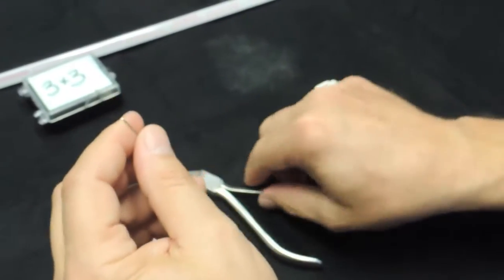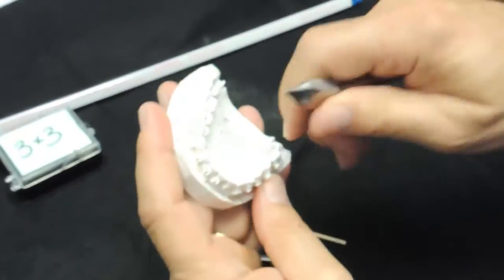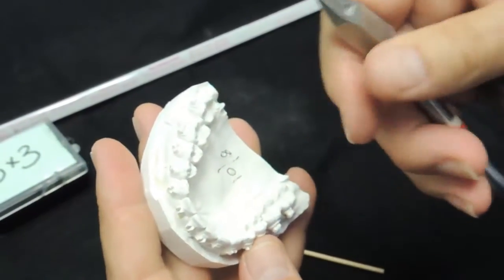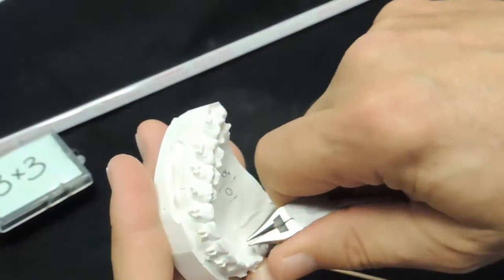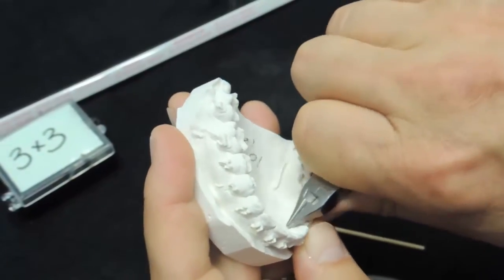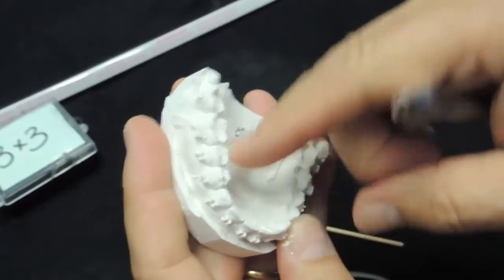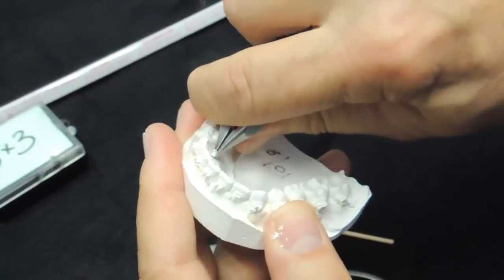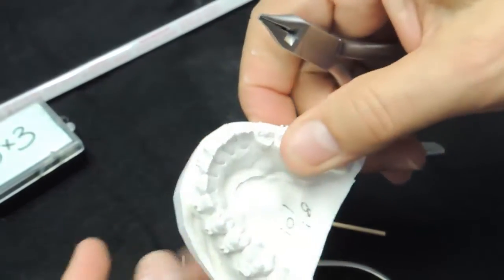The first thing I do when I'm bending these is I look at the model and knowing ahead of time that I'm going to be using a diamond burr in the model to remove the shiny surface of the enamel, I know that I can make some slight changes just to make it easier to bend the wire. So often I'll reduce that mesial marginal ridge of the cuspid a little bit just to make an easier transition there. And then in the mouth I'll do the same thing.